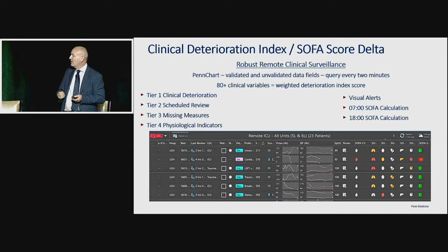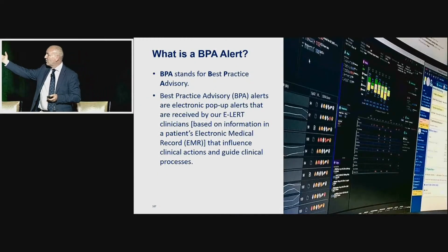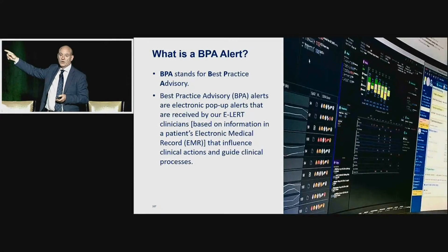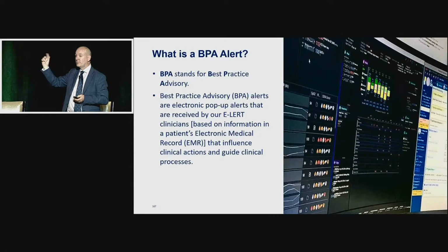But you can see here, this is the clinical deterioration board, 4-hour trends. And then this gives you an idea of what the interface looks like on the right here. And we've got 4 patients parked on high watch. And then we can still use this screen in the middle. It's a widget screen. I'll show you how that works in a minute, because you can just spin the boxes and get whatever you want in them to save your real estate.